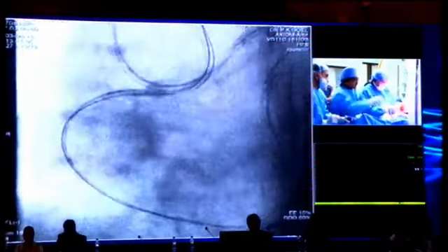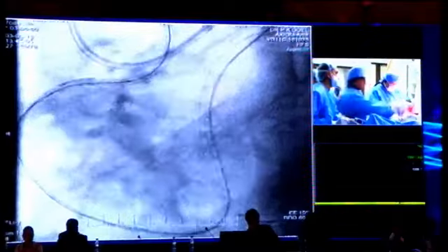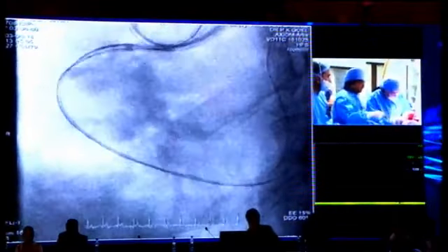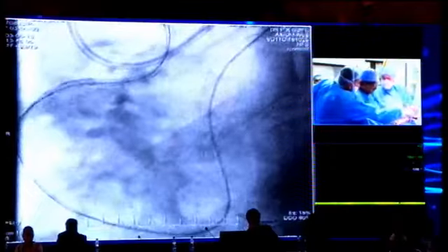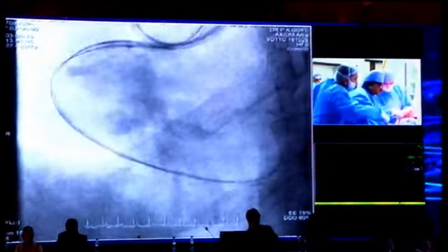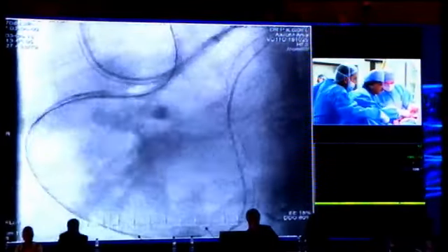Yeah, Dr. Boyle, now we have a lot of blood on our hands. Wait, it is out. RG3 wire is out on the other side, and now can you see it, or you can't see it then? Two elderly physicians trying to find the wire. Just a sec. Where the hell is it? No, it's probably. Where the hell is it?